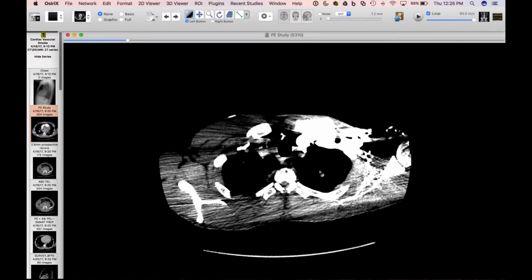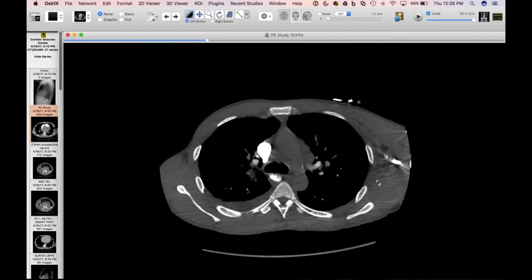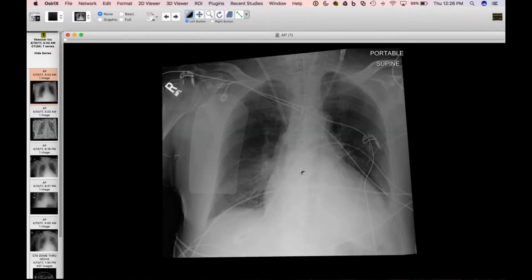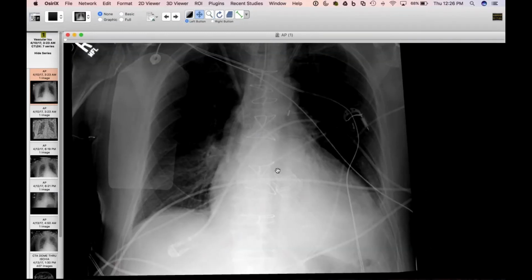So we use it as our double rule out routinely because it looks better than the aortic studies. Yeah, exactly. I mean, we need to adjust our protocols because we're just wasting all of this contrast. No, I'm glad you said that though, Jeff. I may use that as more evidence to push us away from what we do. I've gone to, for many years, a timing bolus, like a test bolus of 20 cc's, because you learn the patients that have heart failure. It's not based off the first peak that it hits a certain threshold, it's based on the curve. So we've seen a significant improvement with using that, but it's a little extra contrast and a little extra time. Yeah.